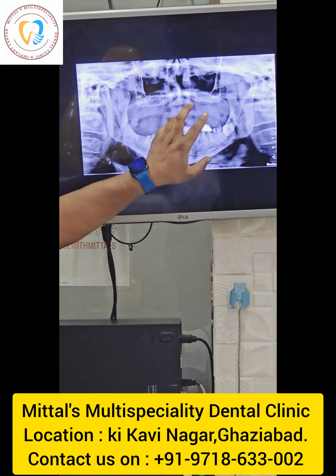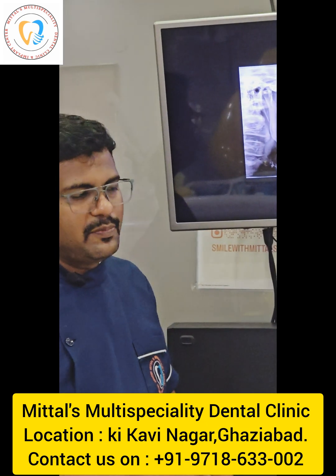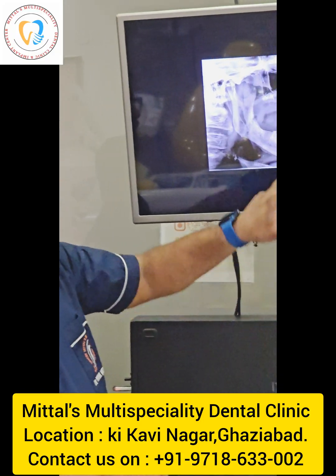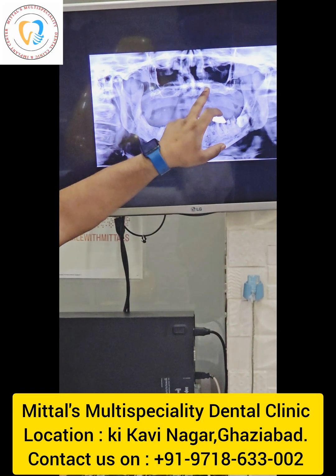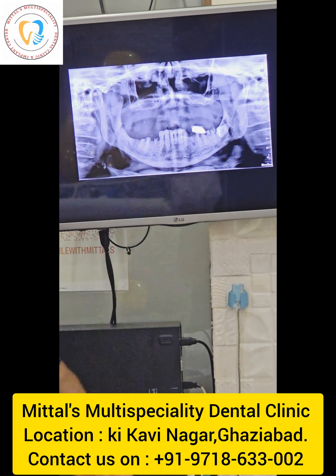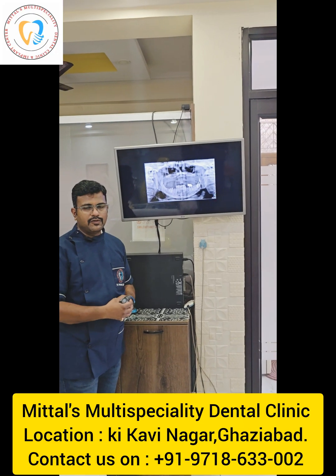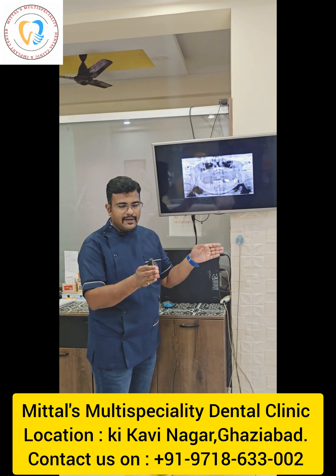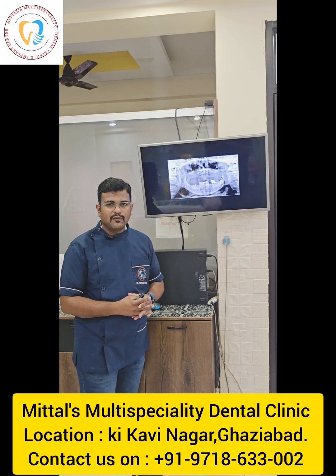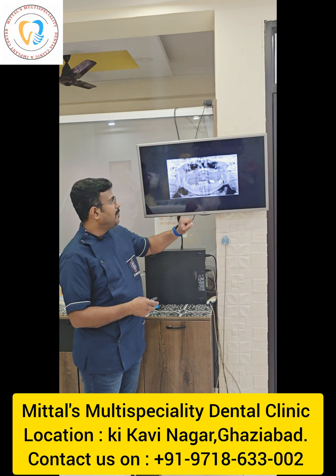we can see there is expanded pneumatized sinus in both the arches, which makes it very difficult to place any implant in this zone. So even if I leave any implant in the nasal area and then directly put the implant in the pterygoids, then a good amount of space will be left in the anterior-posterior direction, which will give a kind of cantilever to the prosthesis and which can lead to implant failure. So we need to eradicate it. The best way to eradicate it is your zygoma implants.